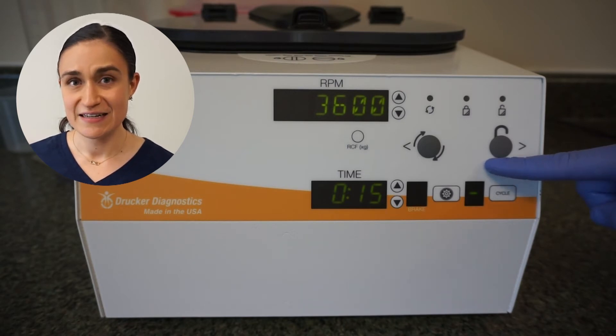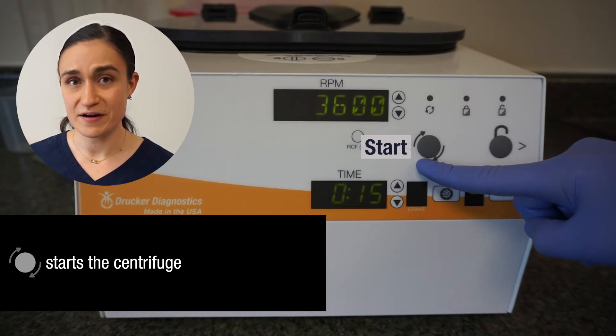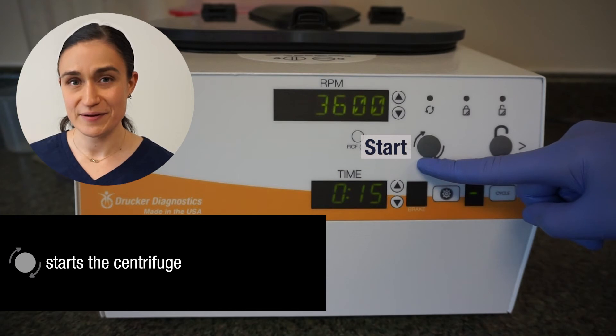The button next to that is the start button. This will start a cycle with your currently selected RPM, time, and brake parameters.